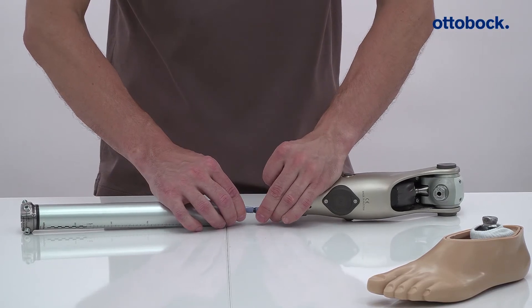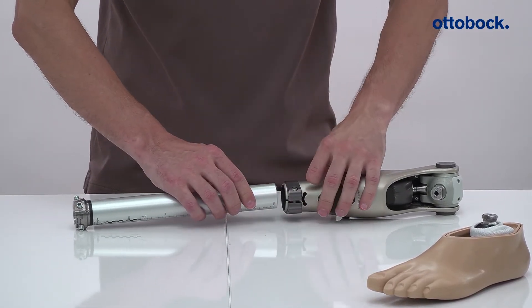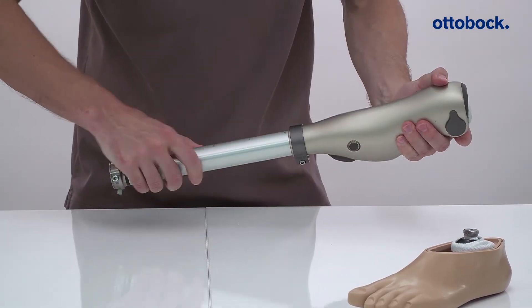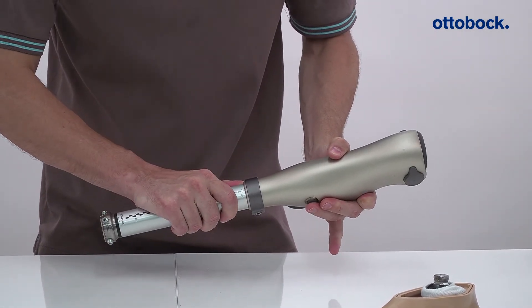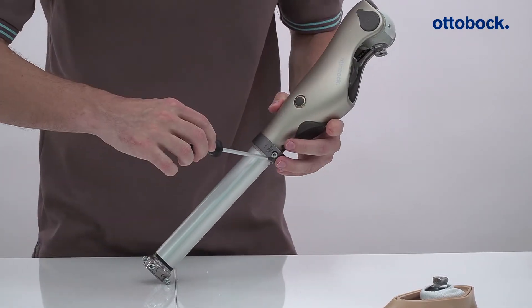Connect the axon tube to the knee joint and then tuck the connection cable carefully into the axon tube. Make sure the axon cable is not pinched when you slide in the tube adapter. Slide in the axon tube up to the stop and then pull it back out by 15 mm. Hand tighten the screws gently.